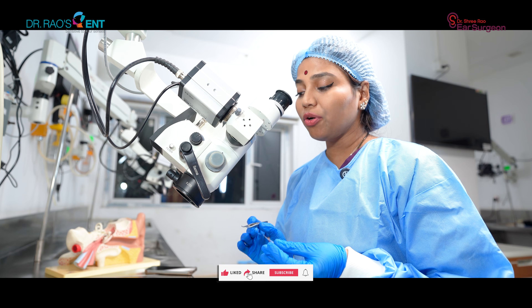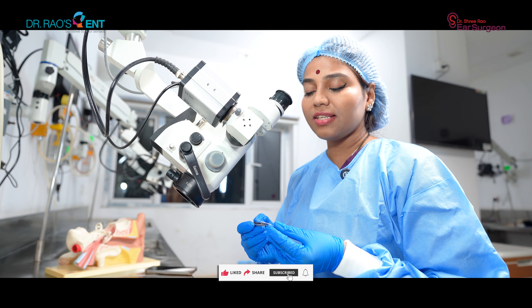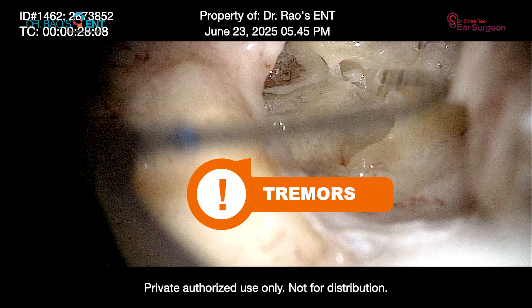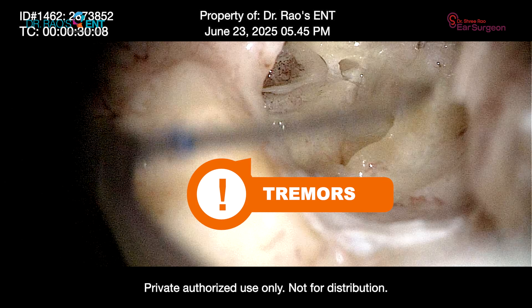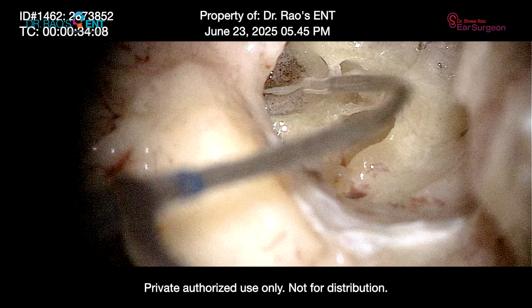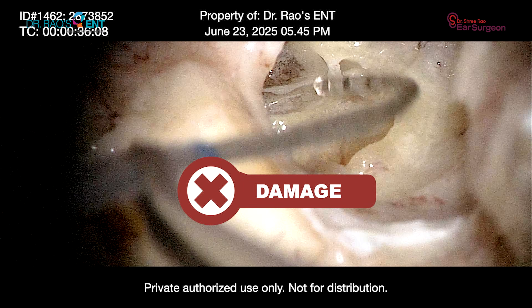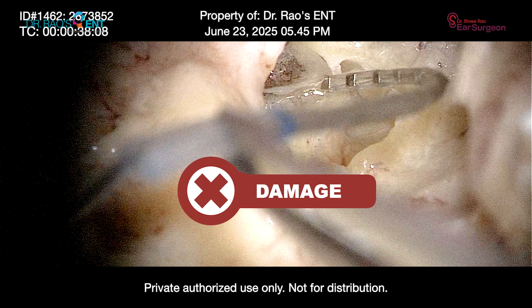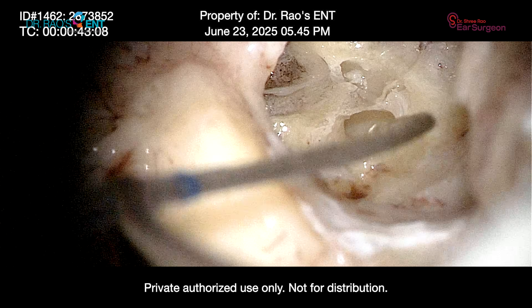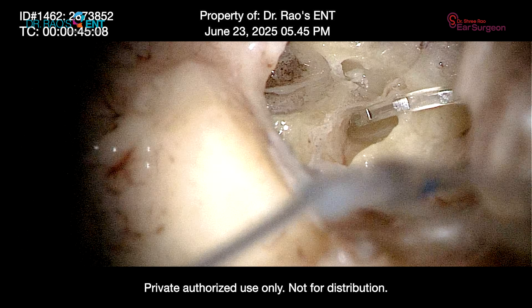If you look at the insertion technique, there were no tremors in my hands and this delicate electrode array was very beautifully threaded into the cochlea. Now watch the tip of the electrode — if the surgeon has a tremor, that micro movement acts like a saw against delicate membranes. We call this trauma, and it results in inflammation which leads to loss of spiral ganglion cells, loss of residual hearing. This is catastrophic.